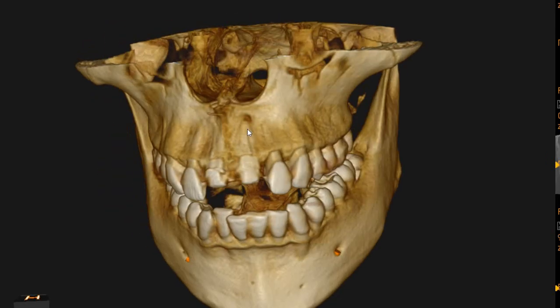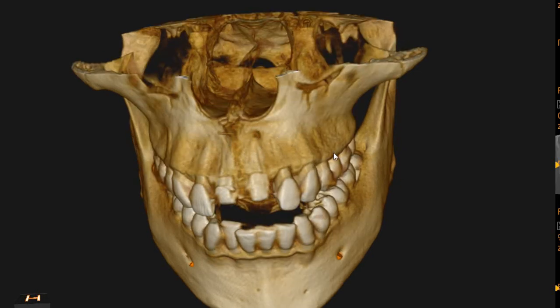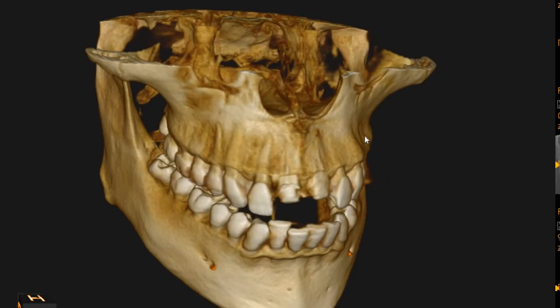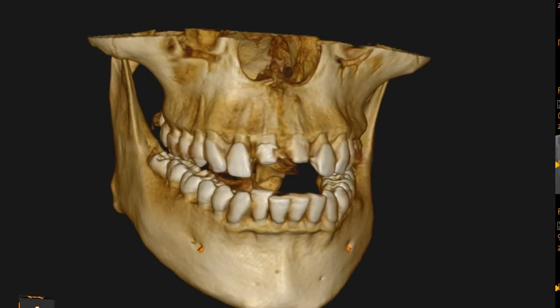This is the 3D rendering. We can see that there is a dehiscence at the apex perforating the buccal cortical plate.